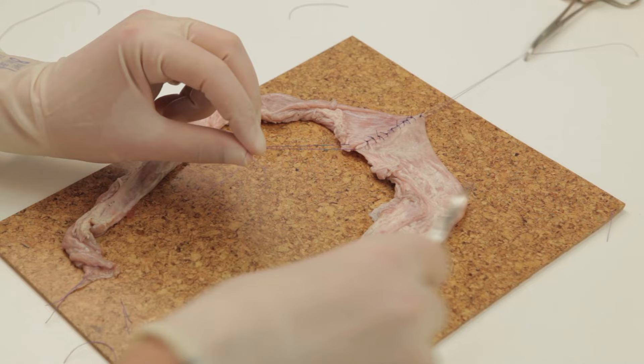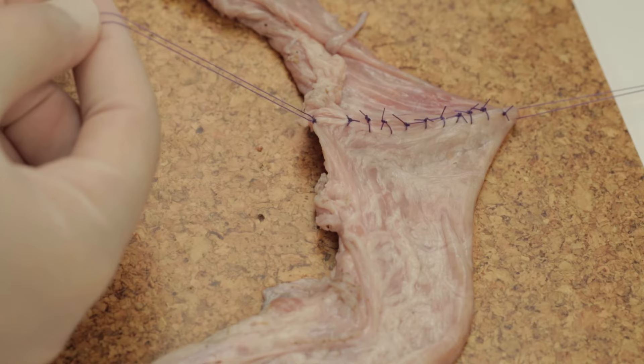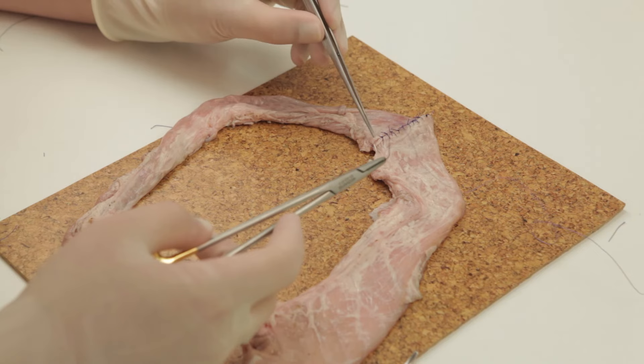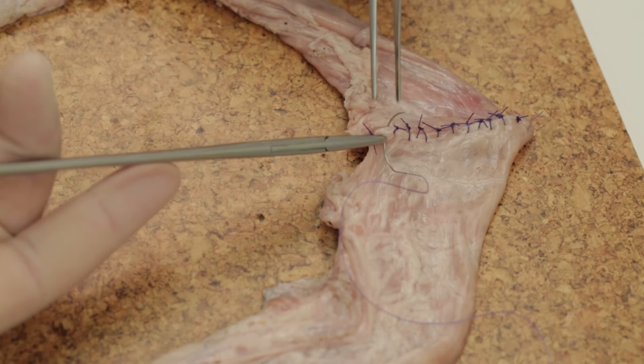One can now tie both stay sutures and inspect the bowel. Here a large gap has been identified, which we alluded to earlier. If this was left, it would be the site for an anastomotic leak potentially, and so must be secured.